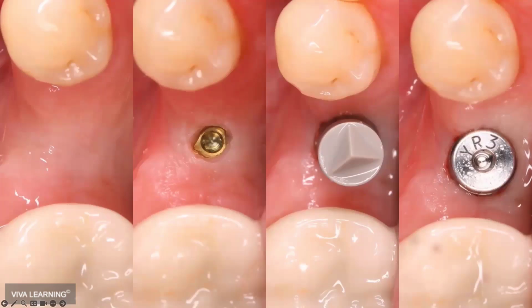In this case, this is Tim's case again, where he did a little sculpture, exposed that implant, placed a Densply Sirona scan body on that, and then placed a healing abutment for healing while the restoration was being designed and fabricated. All day long with this, right?